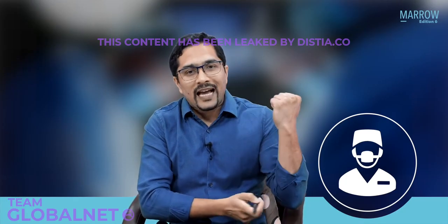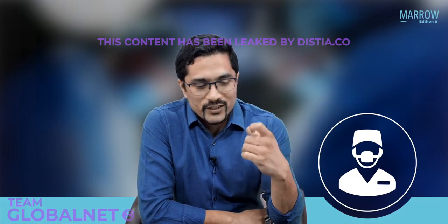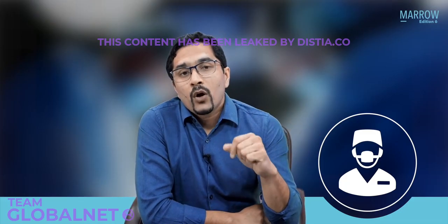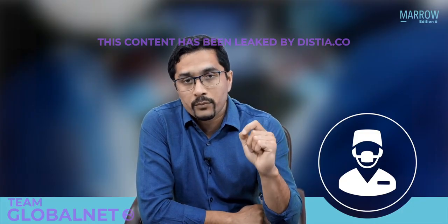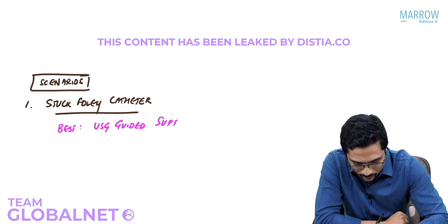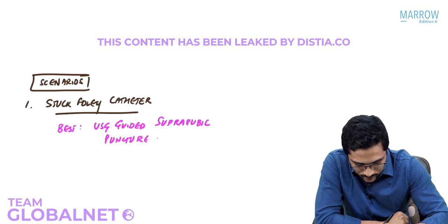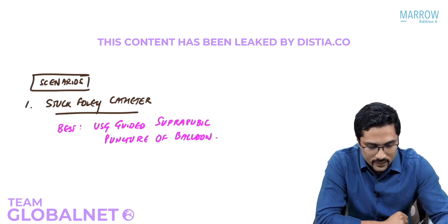Option number 1 is you yank out the Foley's and you rupture the urethra. Well, I'm sure you don't want to do that. Number 2 is you inflate the balloon further and let it burst, but that can also cause trauma. Or you'd carry out an ultrasound guided suprapubic puncture of the balloon. So that is the best management for a stuck Foley's catheter. The best management is an ultrasound guided suprapubic puncture of the balloon. That is what we do for a stuck Foley's catheter.